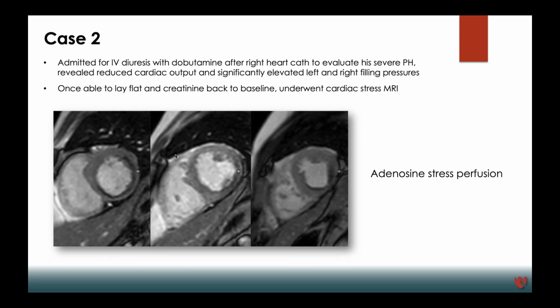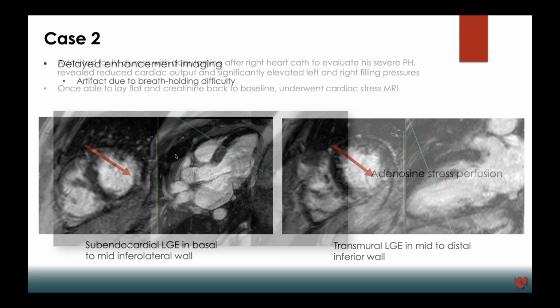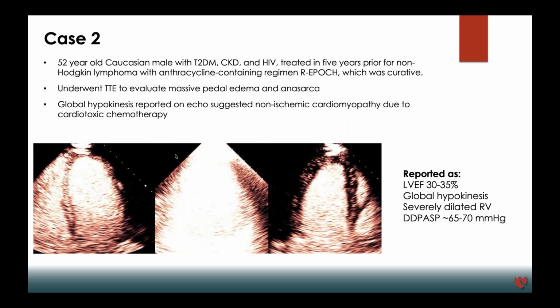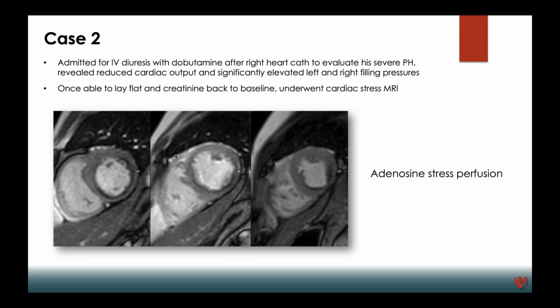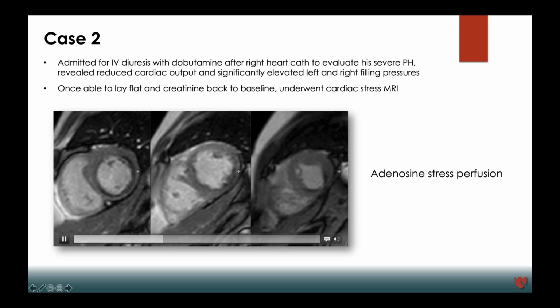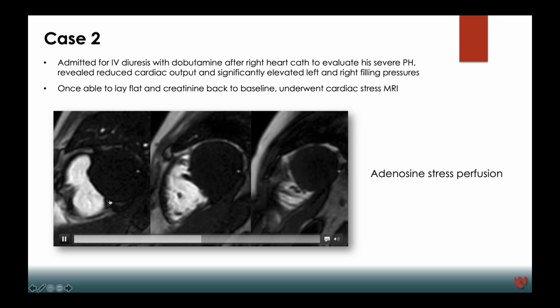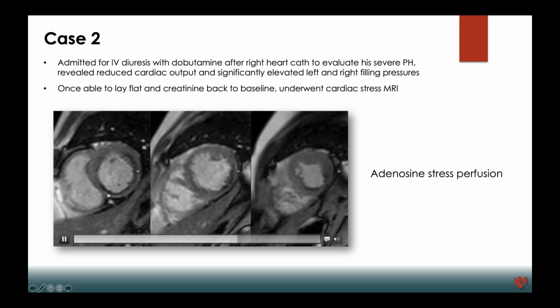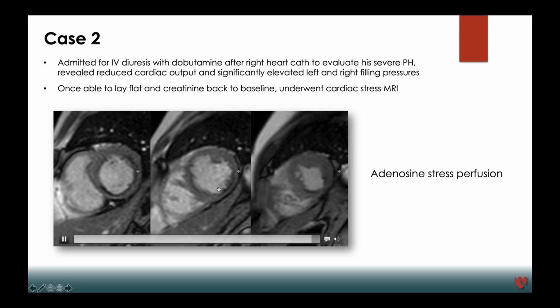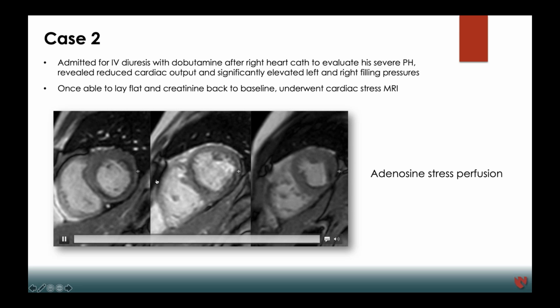Briefly, I'll just say that this was a patient that had suspected doxorubicin cardiotoxicity, with a drop in their ejection fraction, but ended up getting a cardiac MRI, with very abnormal stress perfusion. I think it's interesting for you guys to see this. Subendocardial perfusion abnormality, representing ischemia all throughout the inferior septum, all the way out to the anterior lateral wall, from the base down to the apex.